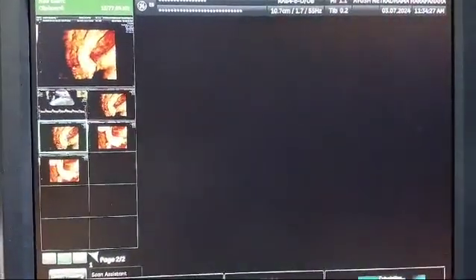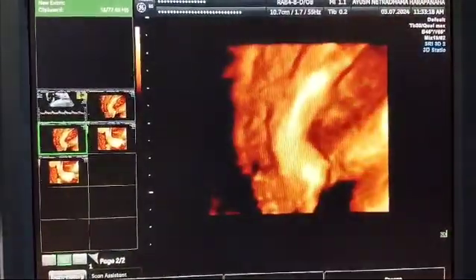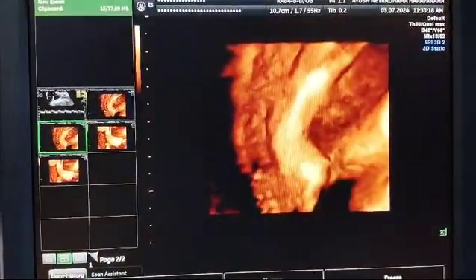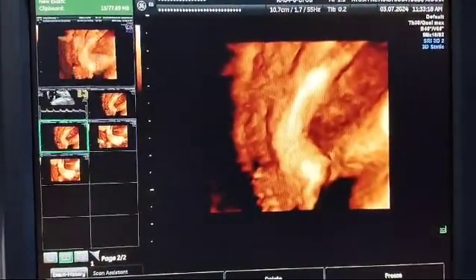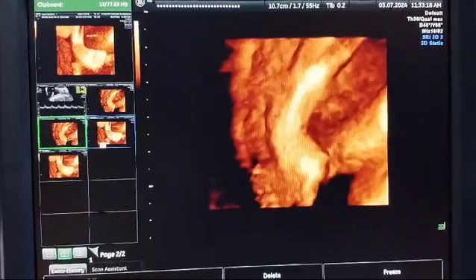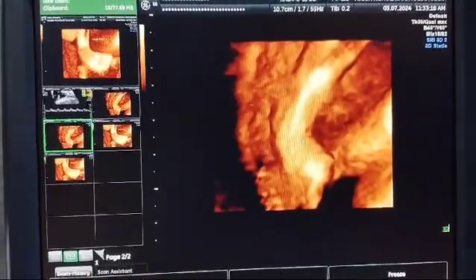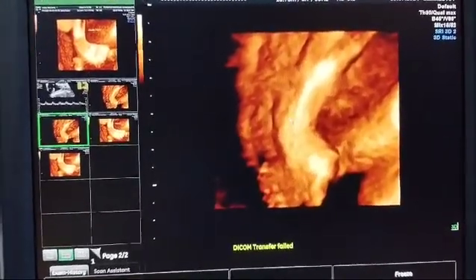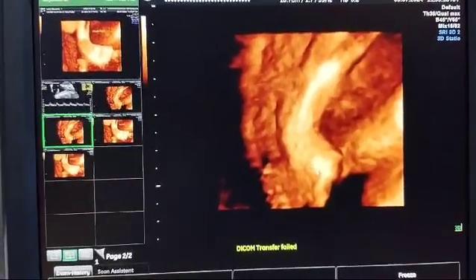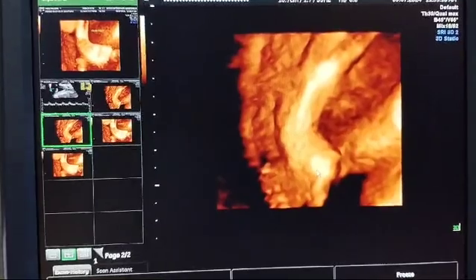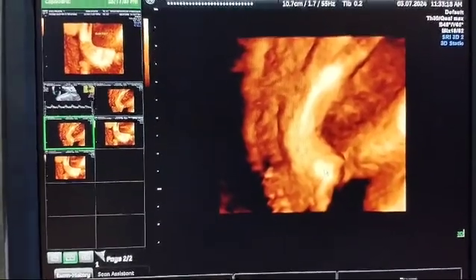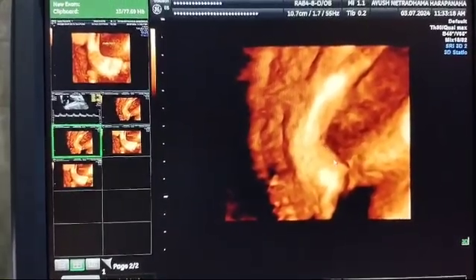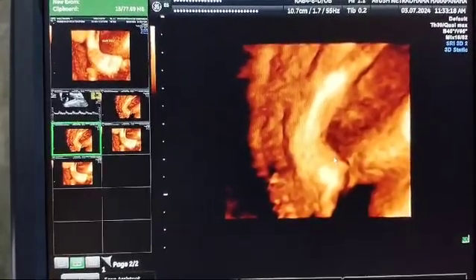Here it is very much evident regarding the equinus deformity. You can see the leg here, the ankle and the equinus deformity of the foot. This is the great toe and this is the medial margin of the foot.